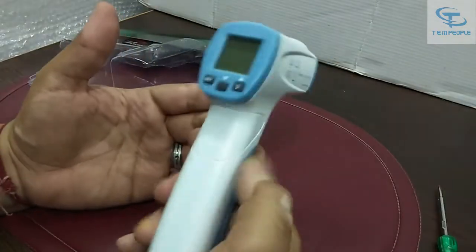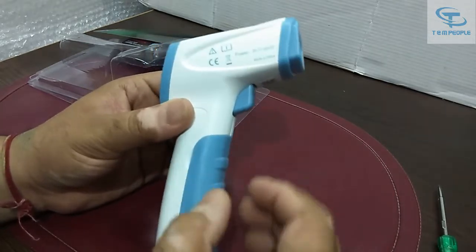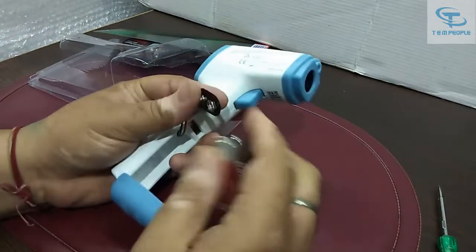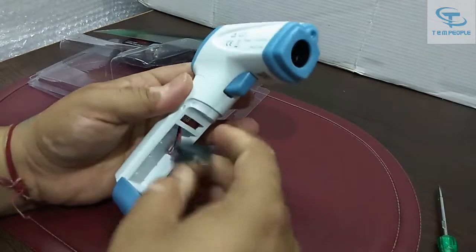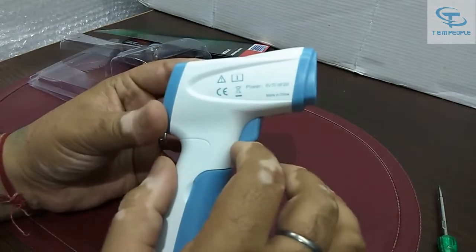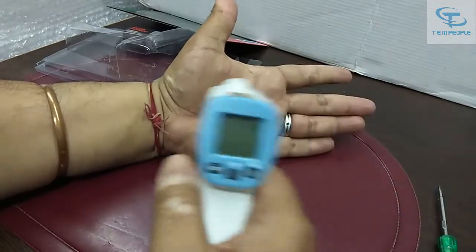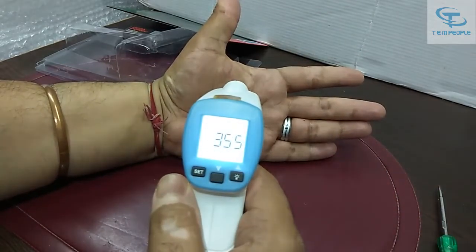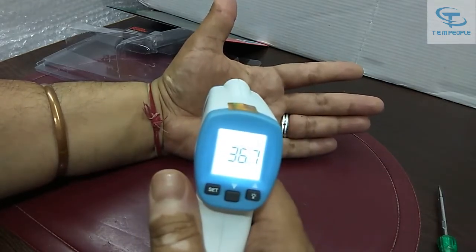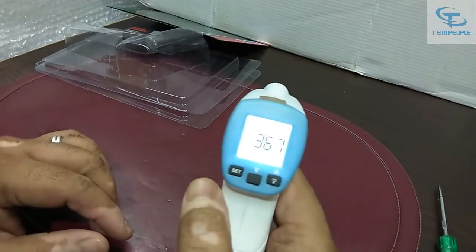It's simple to use. There is a part which we open to put in the batteries. I've put the battery in. There's a button, and when you press it on and hold it over the body — see, I'm holding it over my hand — it automatically scans and shows the temperature.